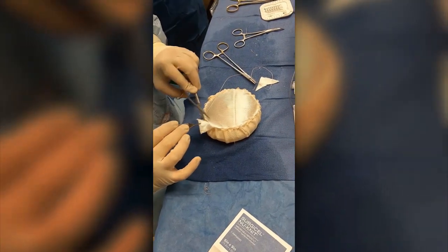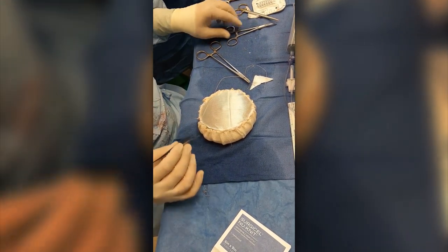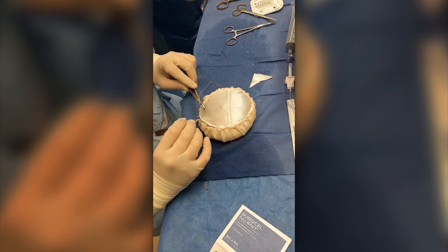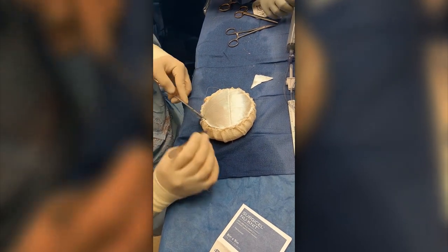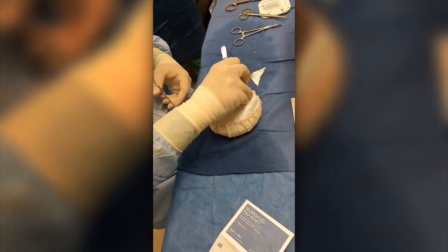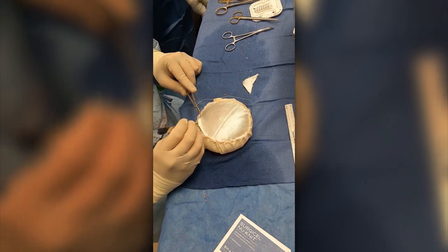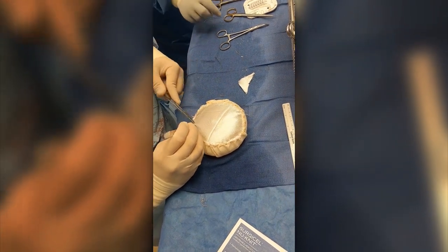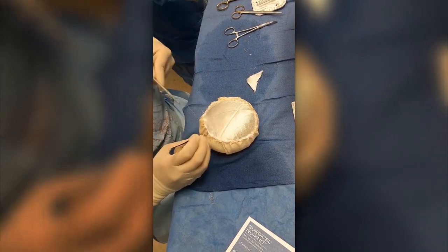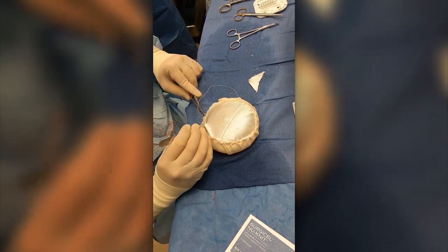I've got my last little bit here. Like I said, I've been sort of tailor-tacking as I go; now it's cut to shape and size and I'm going to put the last few bites here, tie to my lead knot, and end up with a nice totally covered back wall with this very sewable hemostatic agent that will be there for about a couple of weeks while this is all setting into place in the mastectomy pocket.